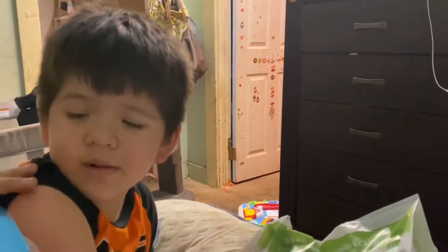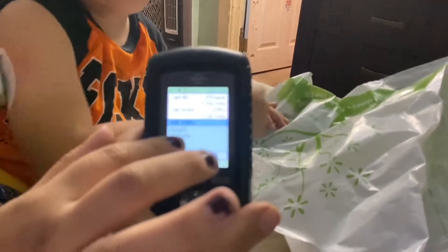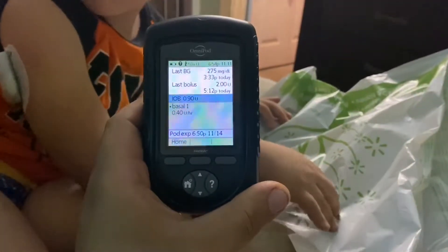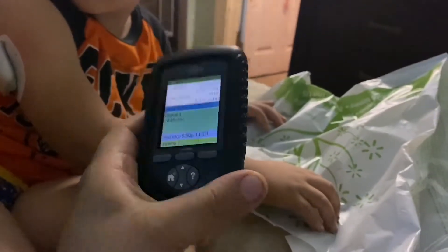Now let's just press start and it'll start his regular basal. No blood. Right now he is getting 0.4 units every hour — that is his regular basal rate.